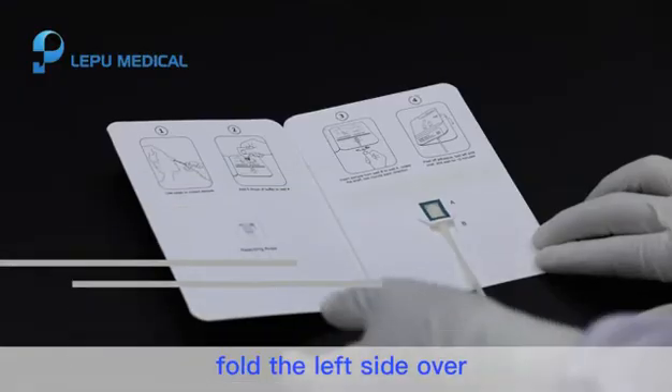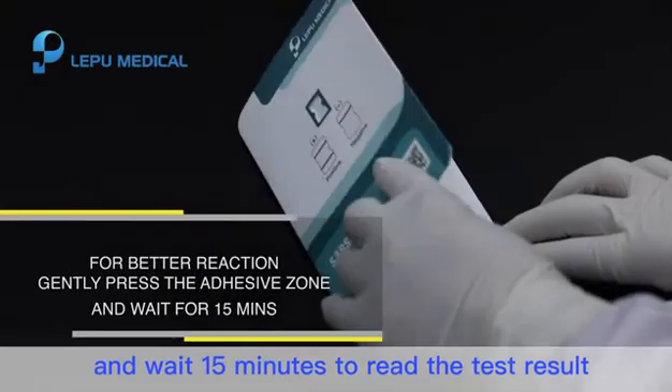Step 6. Fold the left side over and wait 15 minutes to read the test result.